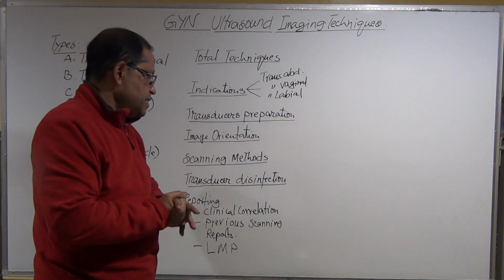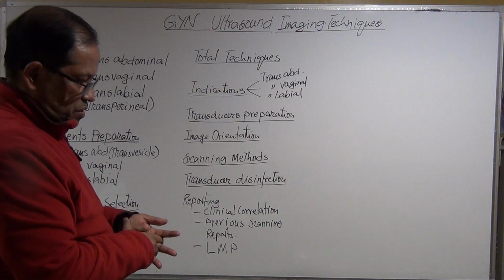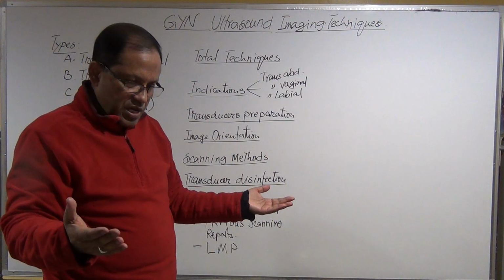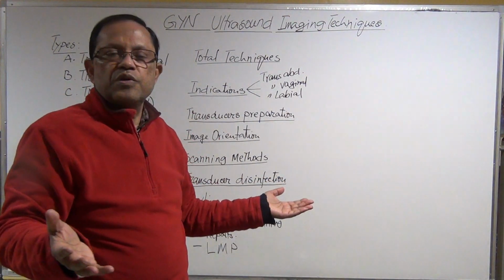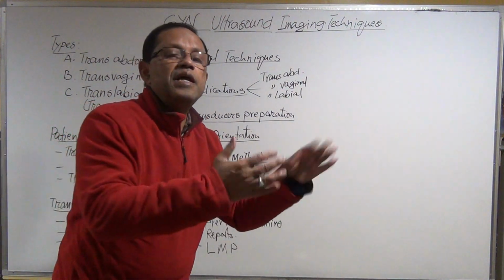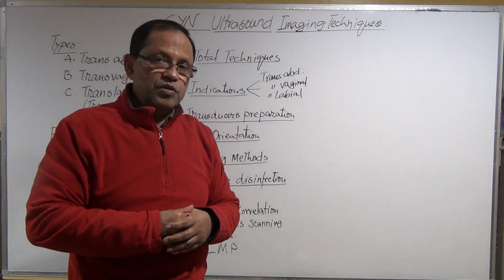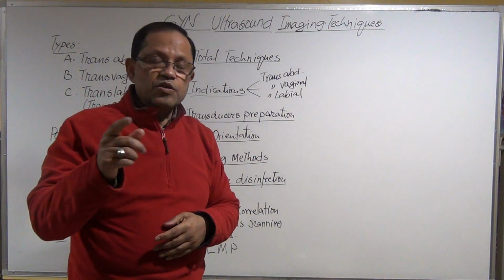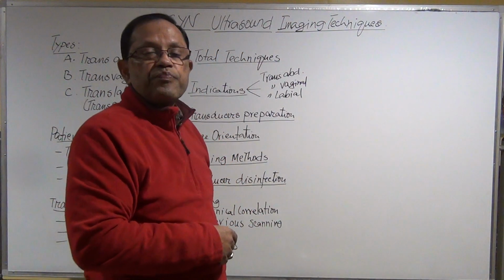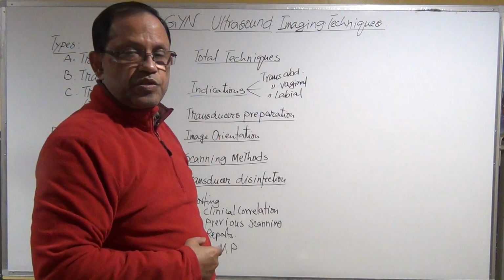Then transducer disinfection. We need to learn how to disinfect the transducer, because these transducers are going to be contaminated with germs, and we cannot use that transducer without cleaning it of germs, or sterilizing it, because there are some notorious bugs like HIV that can be transmitted from one person to another, especially by the transvaginal transducer.